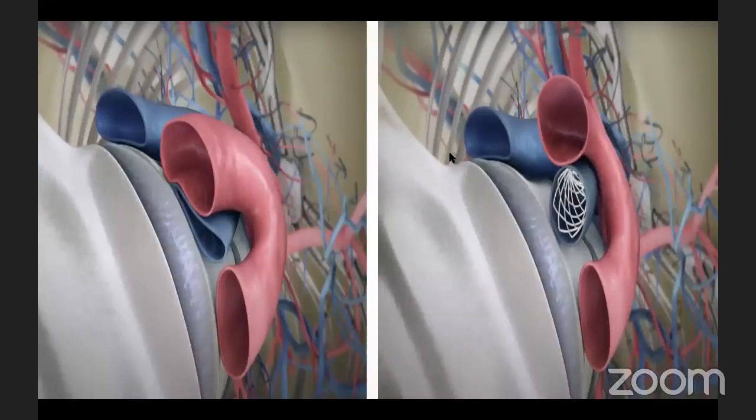This is just from a different angle to show you what the vascular surgeon or interventional radiologist can do and help in patients with the syndrome. This is pre-treatment, and this is after the endovascular procedure, putting a stent and keeping the left iliac vein open and patent. I think this is part one.